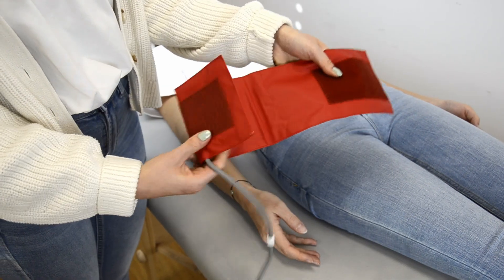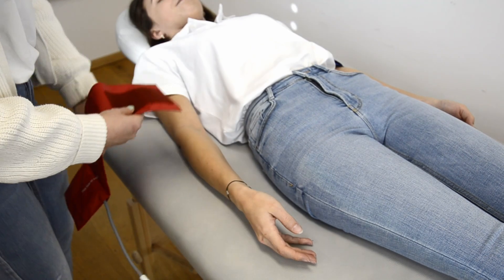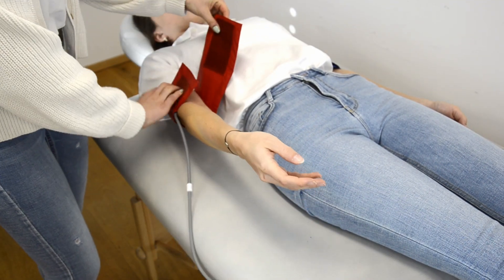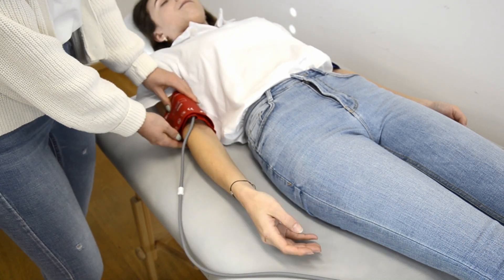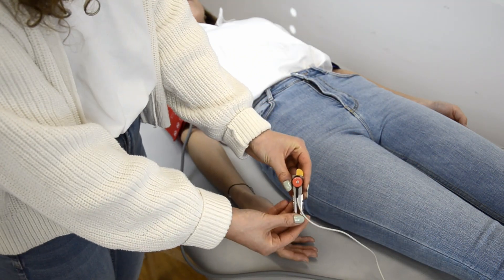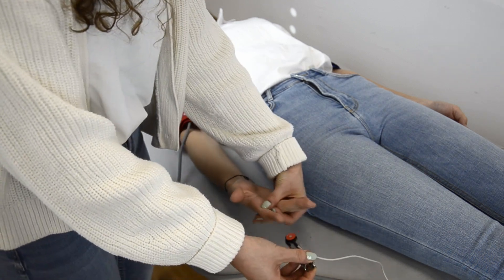Make sure to select the correct size of the cuff. Choose between small or medium cuffs depending on the circumference of the upper arm. Make sure that the cuffs are equally tight placed on the left and the right side of the body. Place the optical sensors on the fingers and ensure that they have full skin contact.